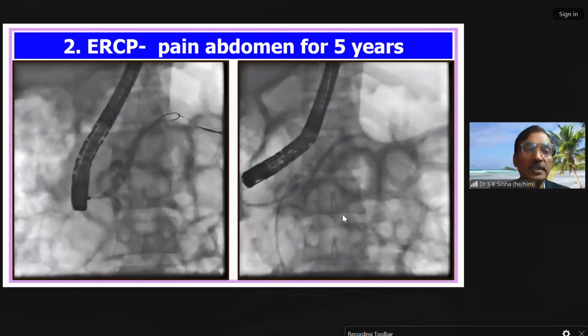So here you see the same patient, where the wire has been passed. When we were taking the accessory class, I was talking about the core and coat of the wire, and that time we talked about the core being made up of nitinol. I said there are several good properties of nitinol, but two undesirable properties, rather than bad. One is poor radiopacity, and the other is poor resistance to acid. The nitinol wire tends to break in the presence of acid. So acid tolerance is poor.